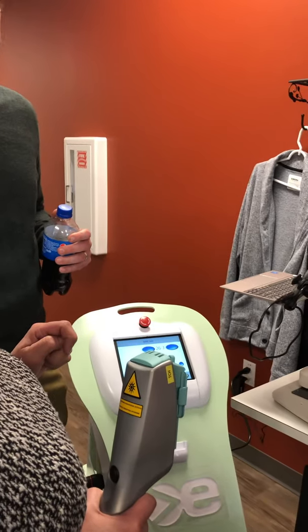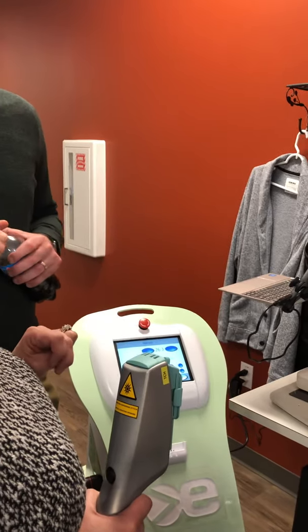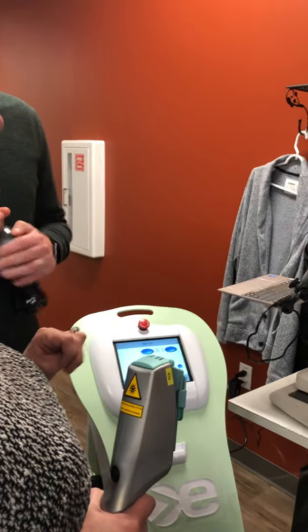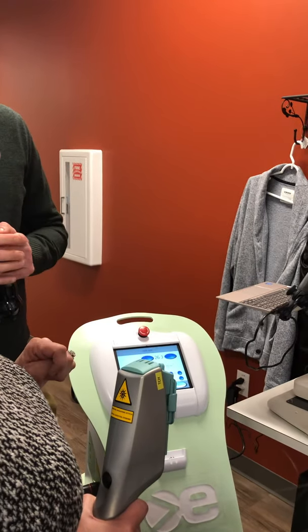Do you want us to hit that age spot right there? Do you want us to hit that hair that's coming out right there? But I'm letting you know that if I looked at you, you have rosacea, that creates dry eye. I'm going after your rosacea because that's causal. Because that's part of it, yeah.